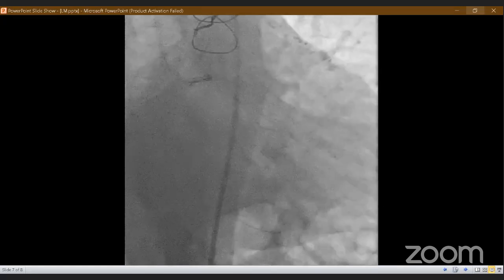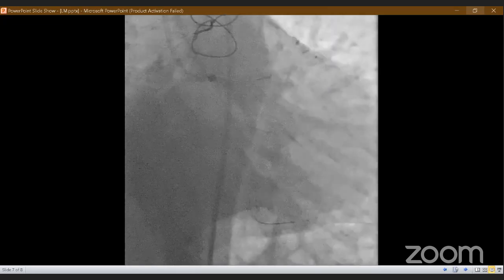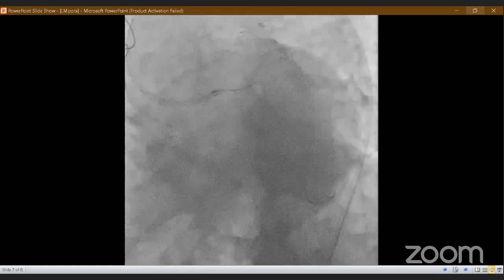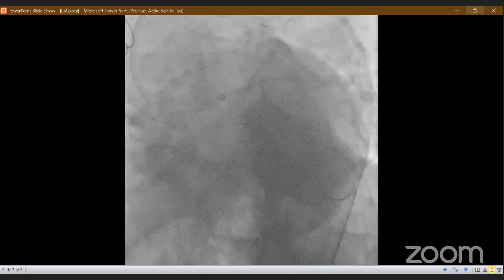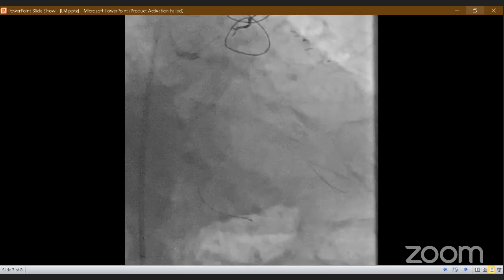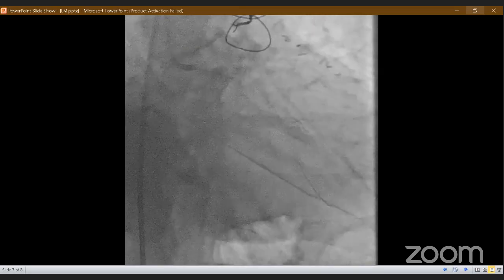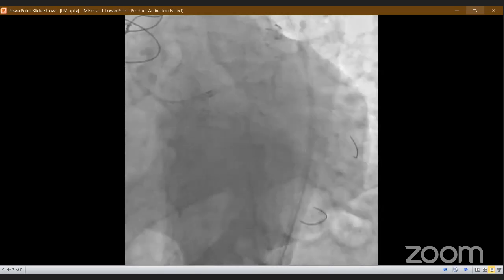If it is a 1-1-1 trifurcation lesion, we have to use at least a 2 stent strategy. I think the DK crush or the step crush is the most appropriate here, so as not to have any protruding metal inside the main branch, because with the TAP technique, which one will you put the side, the ramus or the left circumflex? So mini or step crush or a DK crush, considering 2 stents, is the best rather than putting 3 stents. Sometimes if the angle is good, we can make it just a T stenting technique, the classic T stenting without any protrusion, if the angle is good with the left circumflex and the left main LAD.